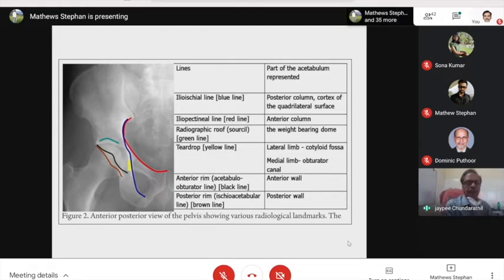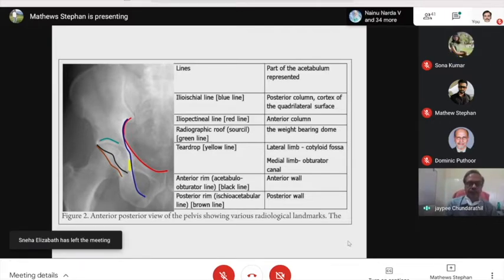Second thing is, depending upon the necessity, you can go in for lateral view, oblique view, etc. Some of those views which were used in the past are becoming redundant these days because of 3D reconstruction with a CT scan. So we will be losing that technique of knowing a few fundamental things.